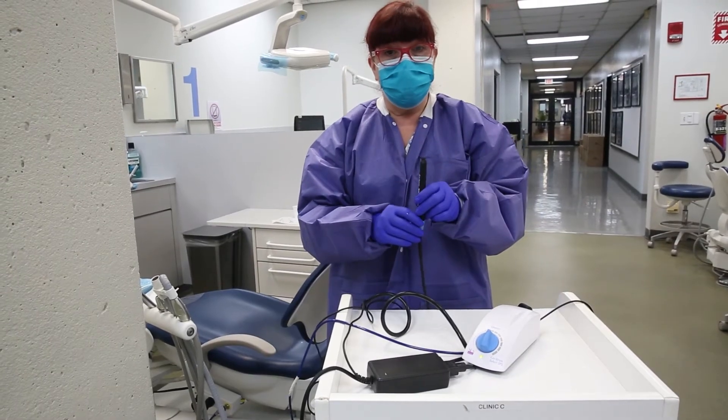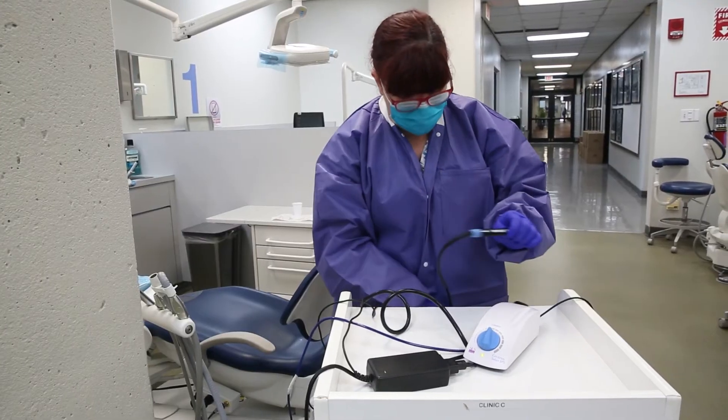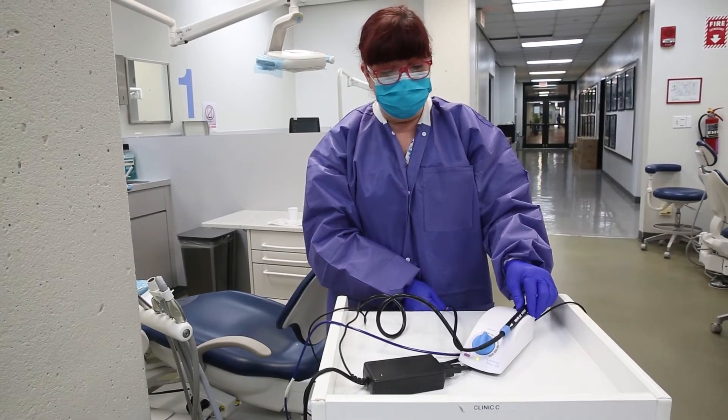At the end of the day, when you are done using it, you could replace the handle here in the holder. It would just hold there on the back of the mobile cabinet, and then you're done.